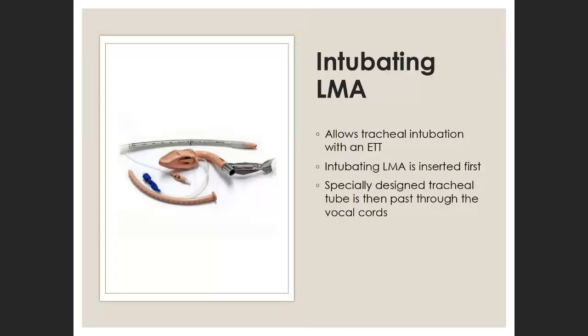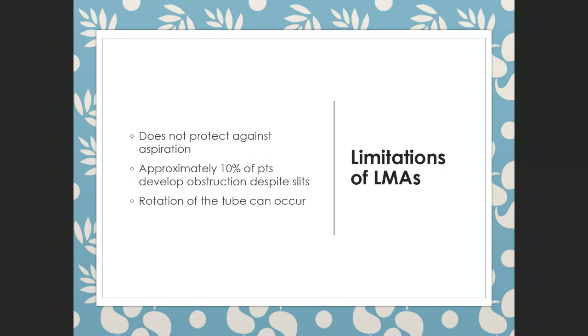And then you have the laryngeal mask airway. Sometimes it's impossible to intubate a patient, and you will deal with the difficulty when you come. When you do pre-op assessments and assess the airway, it can be a difficult airway. But sometimes the rescue method is to insert an LMA, and if that is so, we try to use an intubating LMA so that we can then put a specially sized endotracheal tube through that LMA, past the cords. Usually we can see.